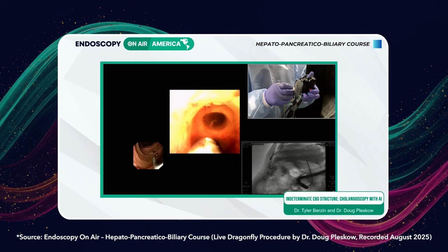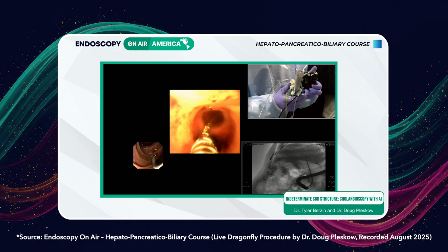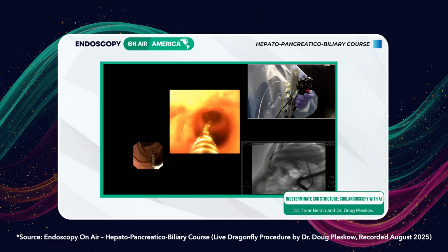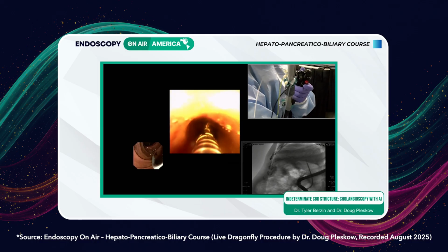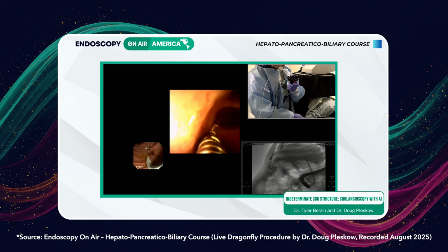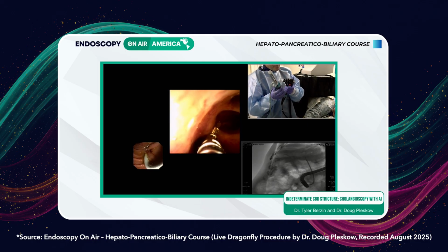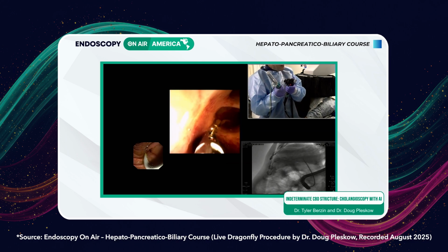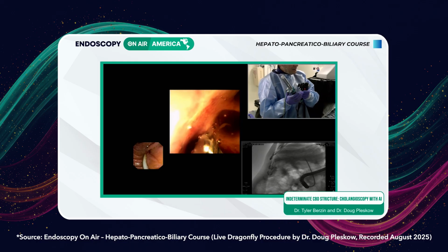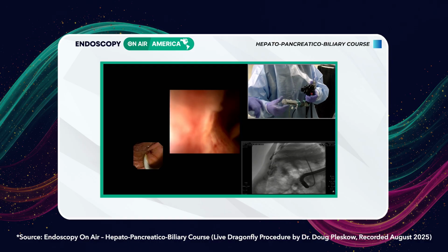So I'm right at the tip. We'll see this coming out, and we'll open G. Okay, and I'm going to advance this. And by pushing this scope up, I think I can get some better pieces here as well. So I'm actually advancing with my hand here, get that biopsy, and it makes it pretty firm. And it looks like we're getting a really good piece here. Close? Good. Okay, now we're going to pull this out. I think we're going to have a pretty sizable piece.